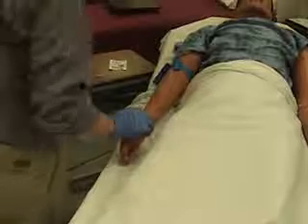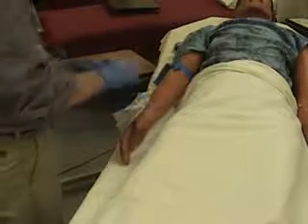Tie the tourniquet above the elbow, and make sure to tie it so that it can be released with one hand. Find the vein you picked. If the patient has a lot of hair at the site, you may need to clip it so that you have easier access to the skin and so that the site can be secured with tape. Clean the site with alcohol wipes, rubbing vigorously.